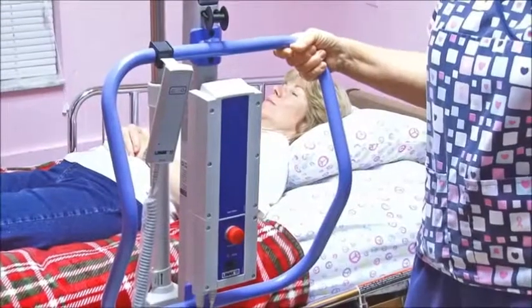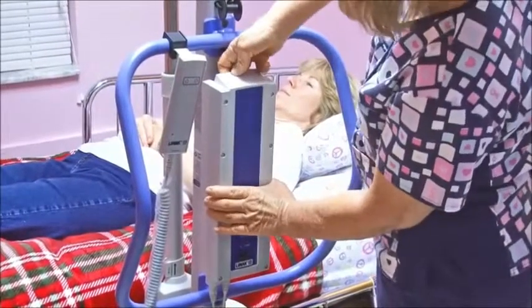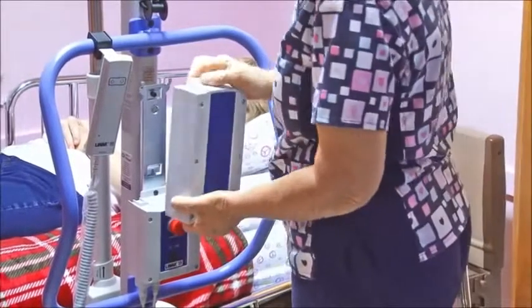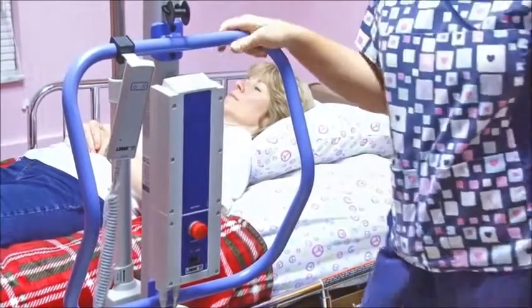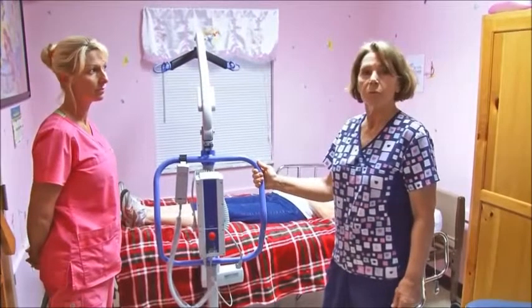To remove the battery pack and replace it, place your hand down here to stabilize it. You're going to lift up, and that is the whole battery pack. To place it back in, you're going to line up the little metal and let it lower, and you can hear that it's clicked in. And I believe we can start the procedure now.